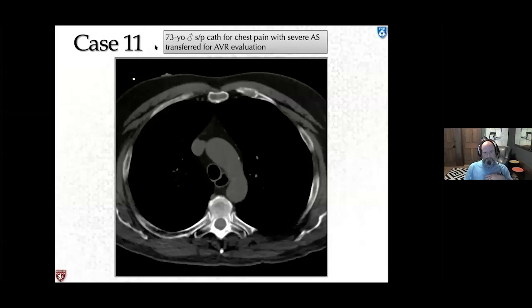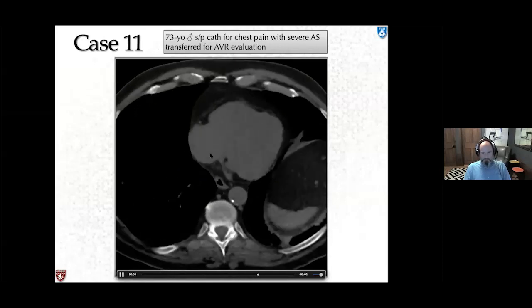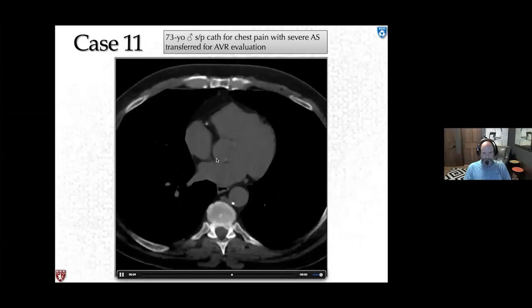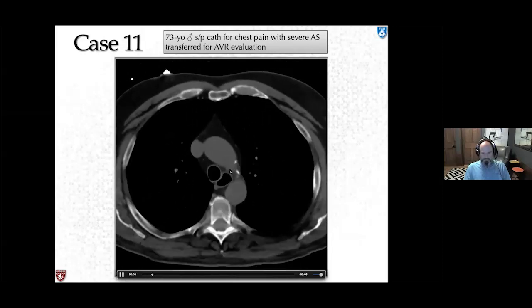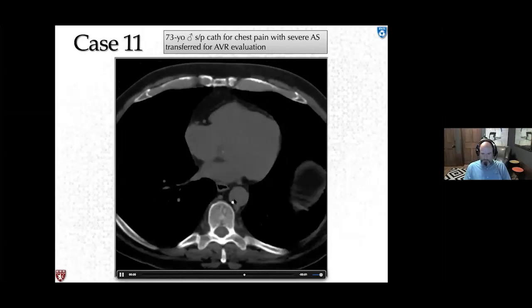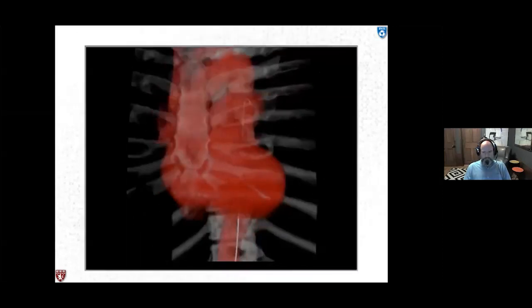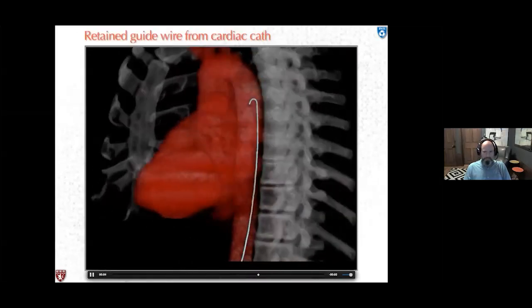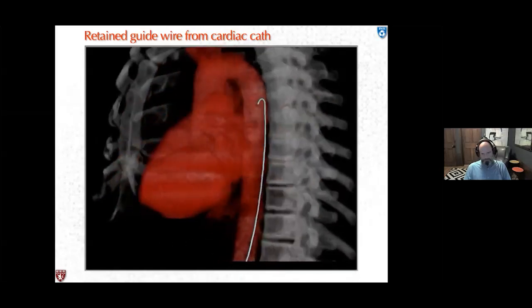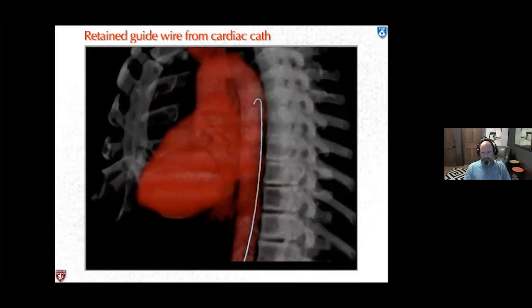Another case: a 73-year-old male status post cath for chest pain with severe aortic stenosis, transferred for TAVR evaluation. On non-contrast CT of the descending aorta, a structure was seen with streak artifact too dense to be calcium — on 3D, this was a retained guide wire from the cardiac catheterization, with no mention in the procedural report.